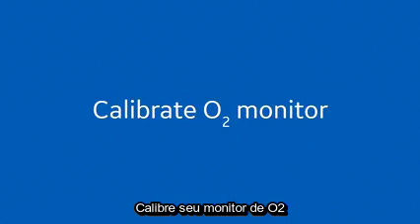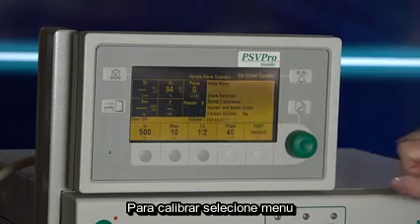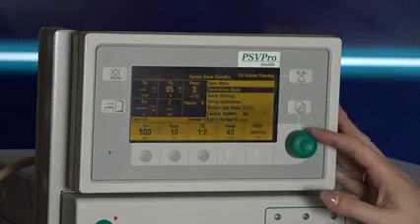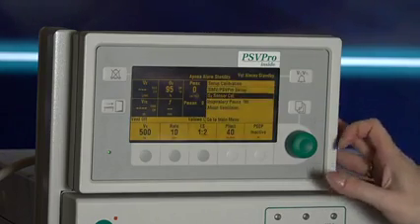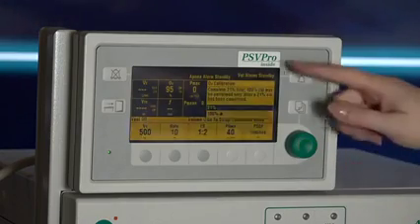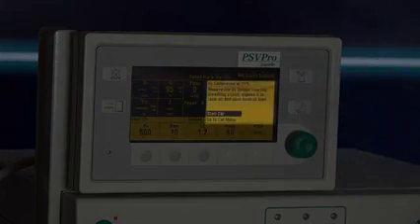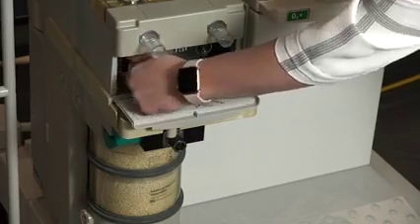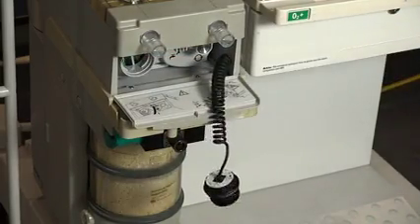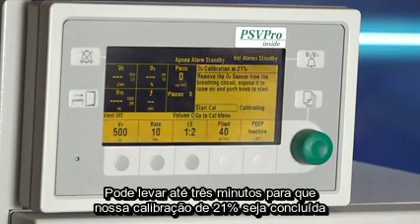Calibrate your O2 monitor. Ensure the monitor reads 21% in room air. To calibrate, select Menu, scroll to Calibration, select O2 Sensor, select 21% and follow the on-screen instructions. Select Start Calibration. It can take up to 3 minutes for the 21% calibration to complete.